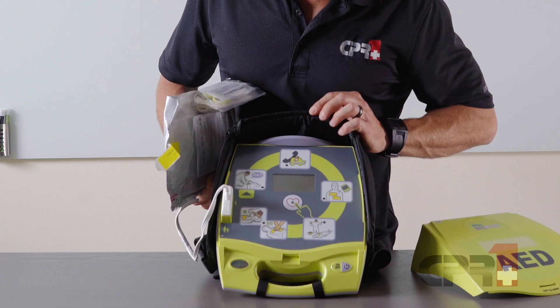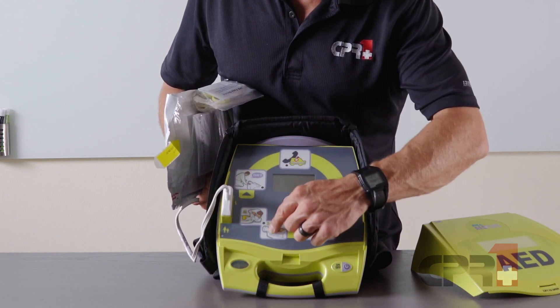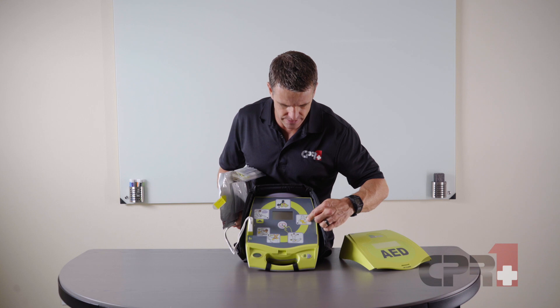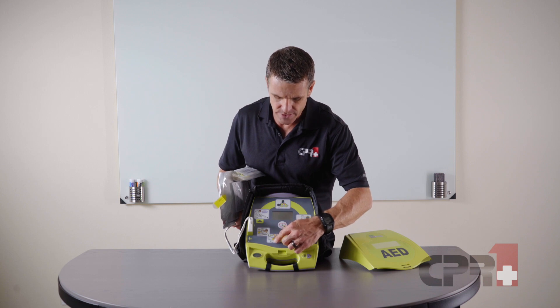The device walks you through the steps of the response: checking for responsiveness, calling 911 and getting help on the way, placing the pads onto the victim, standing clear while it analyzes and shocks, and then getting right into CPR.